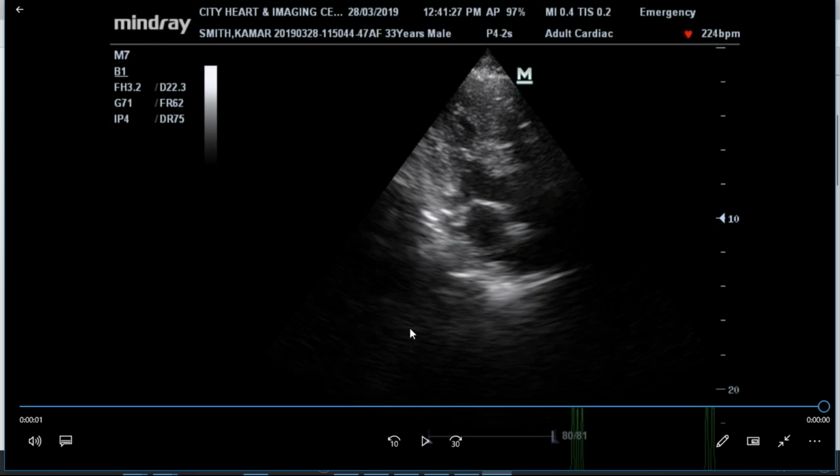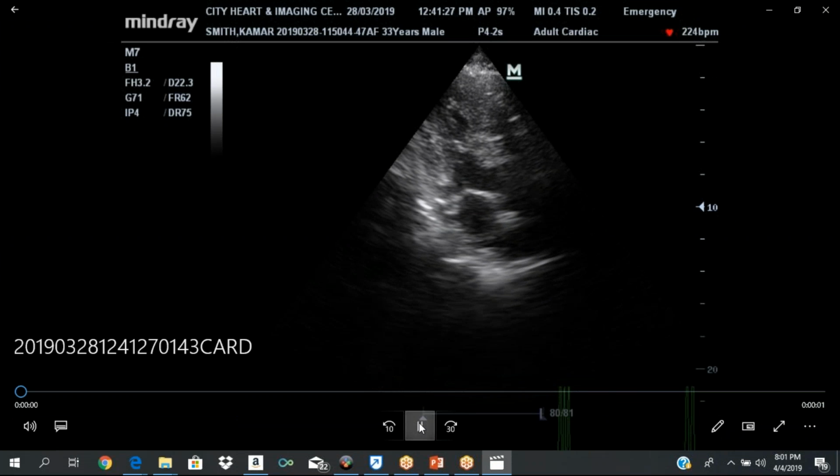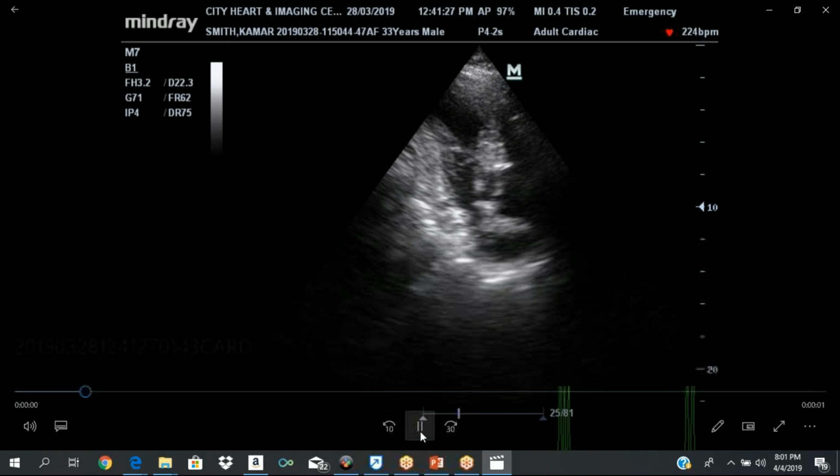Okay, so this is your apical three-chamber view. Doing further counterclockwise rotation. This is your anterior septal wall. This is the inferior lateral wall. LV cavity right there. This is your mitral valve, the anterior leaflet, the posterior leaflet, left atrium, aortic valve, and the ascending aorta is right there.